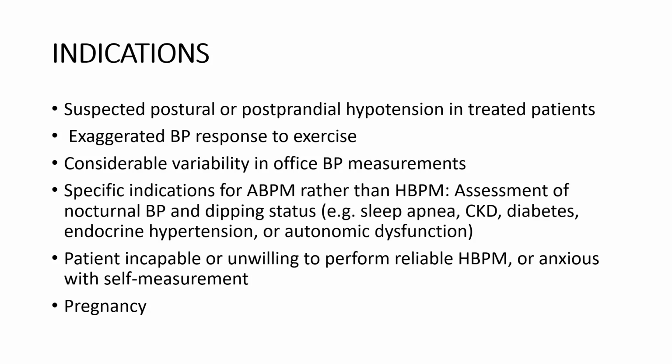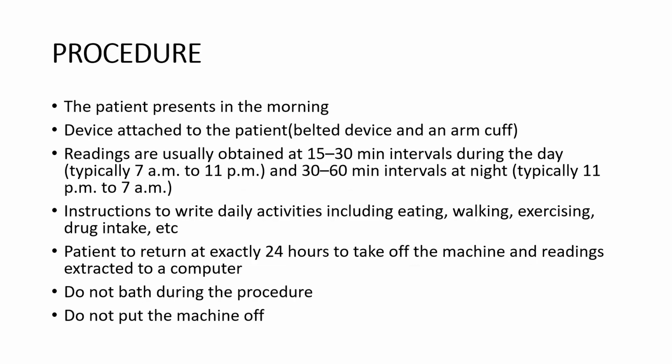So for the procedure, the patient presents in the morning. The device is attached. The patient has a belted device and an arm cuff.